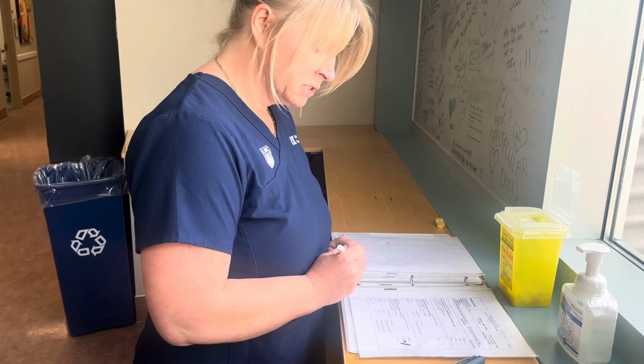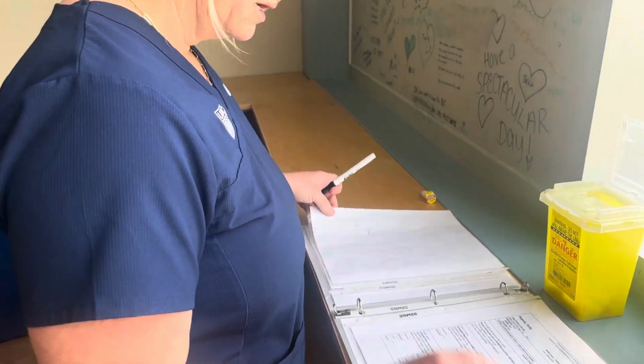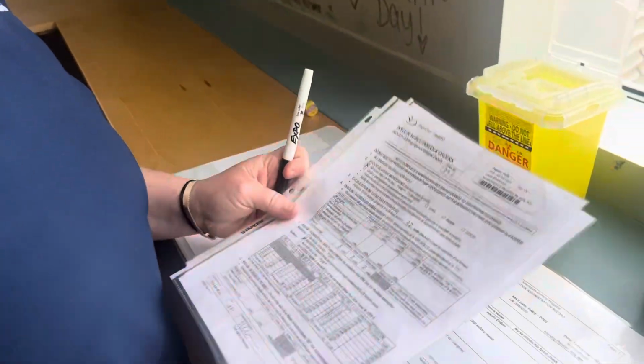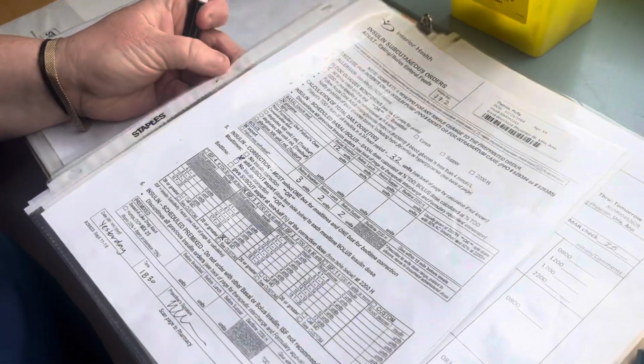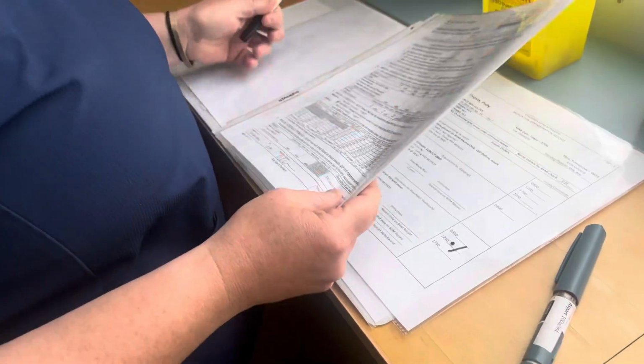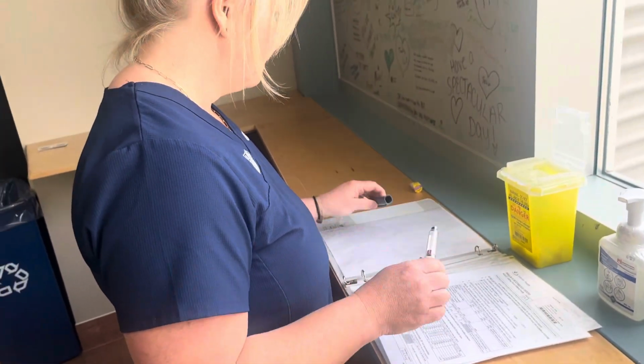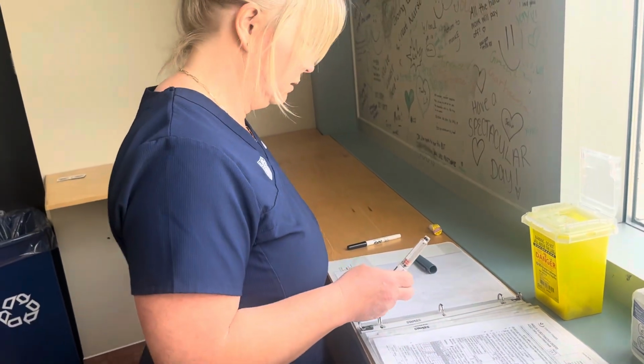At this point, I would get an independent double check because it is a high-alert med. So I'd get another nurse to come. I would present her with this information, the records, the blood glucose records, what the blood glucose is. And then I would let her verify that the dose is correct. So at this point, we're going to prep the pen.